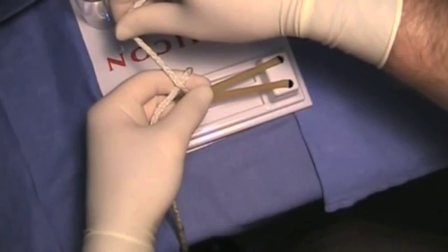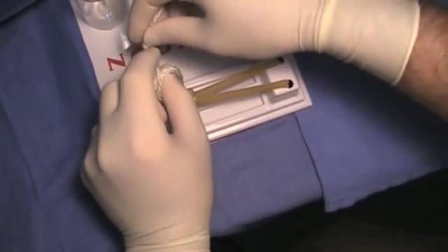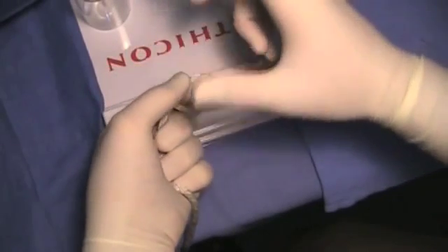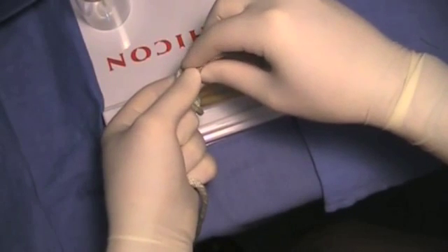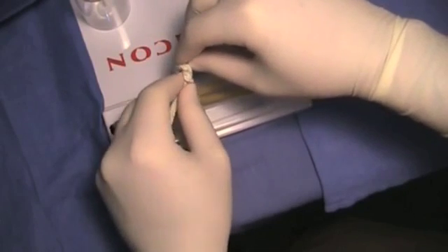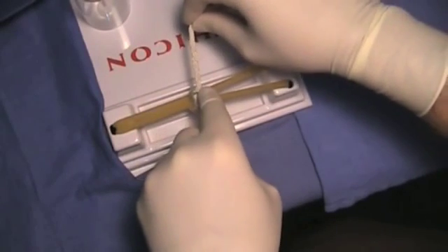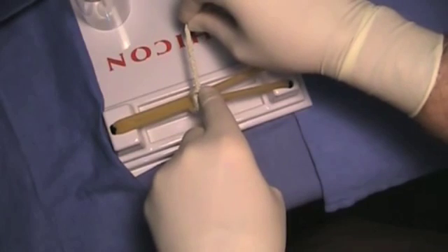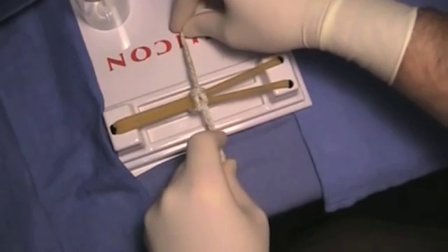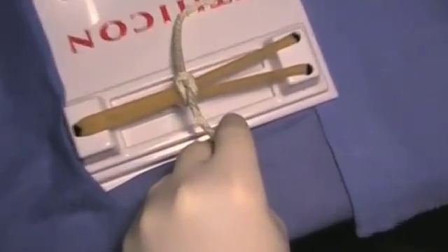Pinch your thumb and index finger together, rotate away from you, release, then pinch and rotate towards you this time. Re-grab the short end with your right hand and for the second throw pull the short end away from you, using the index finger of your left hand to cinch down and secure your knot. This completes your first square knot. You must visualize and confirm this first square knot before moving on to additional throws.